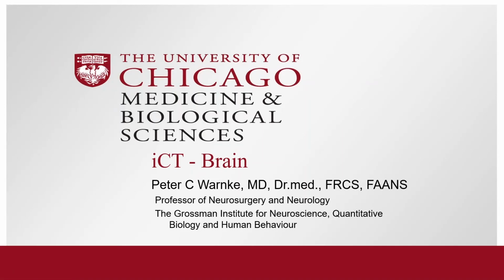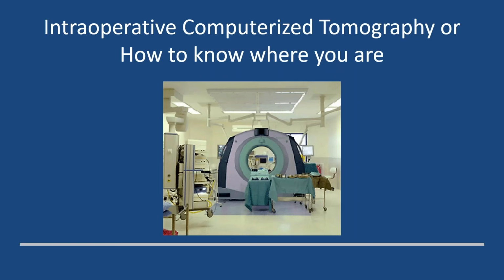Yes, so I'll talk about the intracranial applications of intraop CT, and I've been using that for 20 years, starting with stationary MRIs, and recently, in 2013, when the BodyTom became available, we used that. The whole point is, like spine, that you want to know where you are whilst you do a procedure, and the BodyTom or any intraop CT with a wide bore allows you to do that.